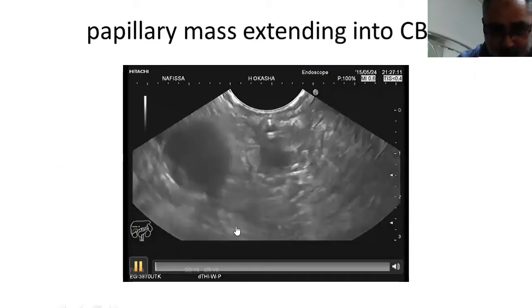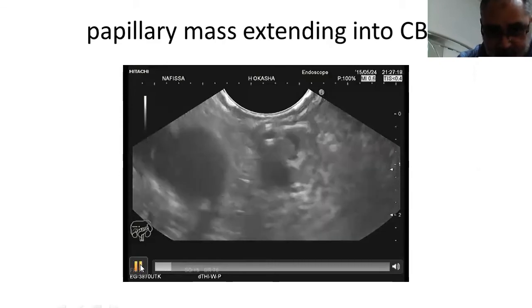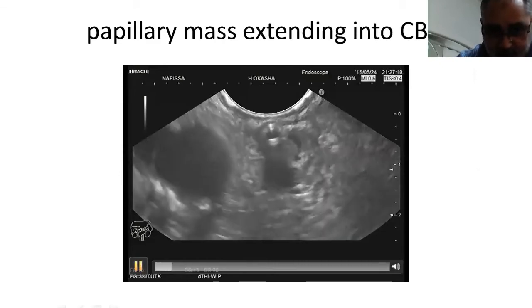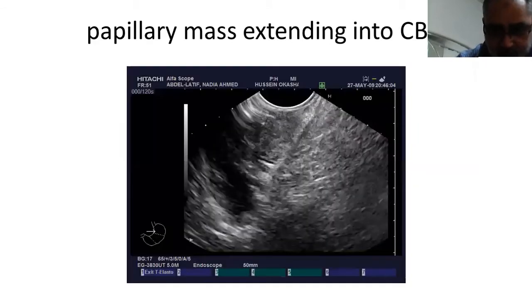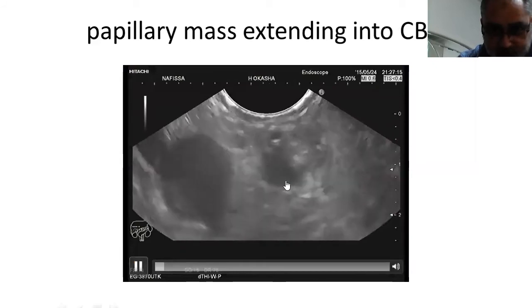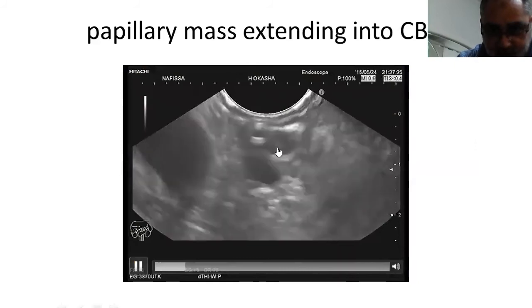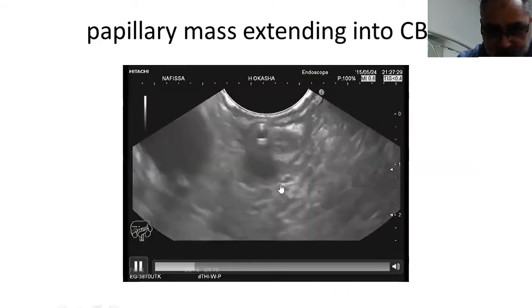This video shows a mild extension of the papillary mass inside the common bile duct. Now inside the second part of the duodenum at the level of the papilla, here we can see a small papillary mass and the common bile duct with a stent inside and the pancreatic duct. And here we can see very small extension of the papillary mass inside the common bile duct, and this is the aorta.